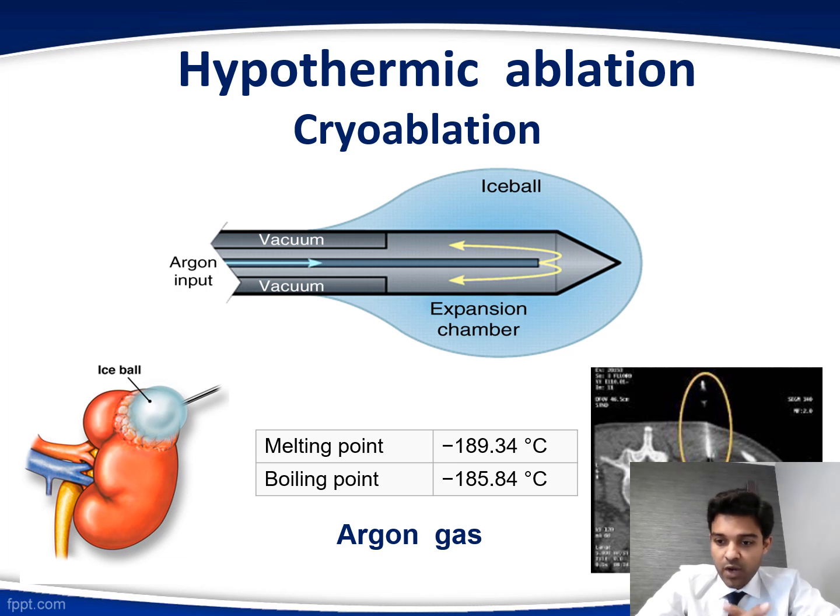Cryoablation is a method of destroying tissue by freezing, that is, extreme cold is used to destroy tissue. Most often cryoablation is performed percutaneously. It is performed using hollow needles, that is the cryoprobes, through which cooled thermally conductive fluids are circulated.